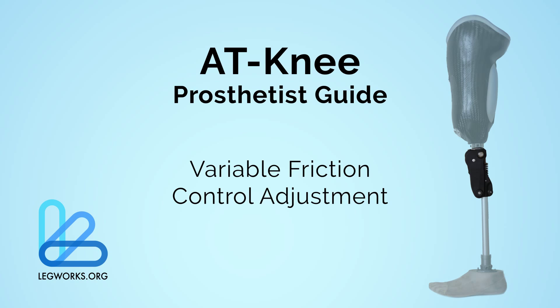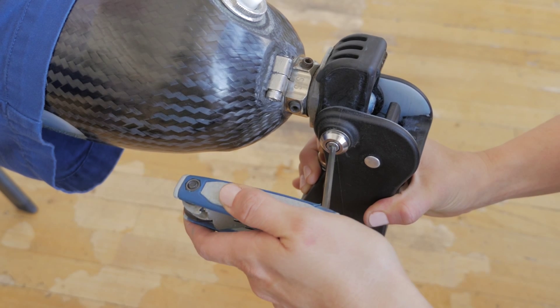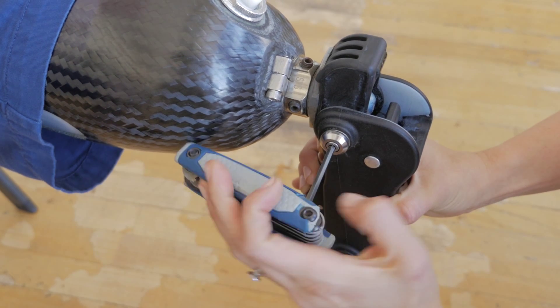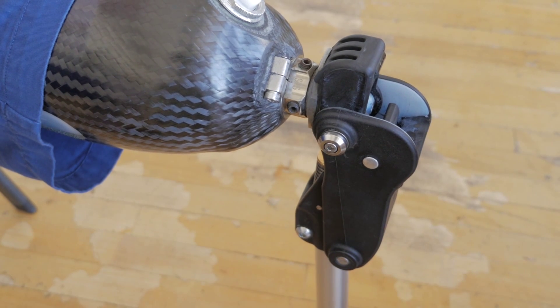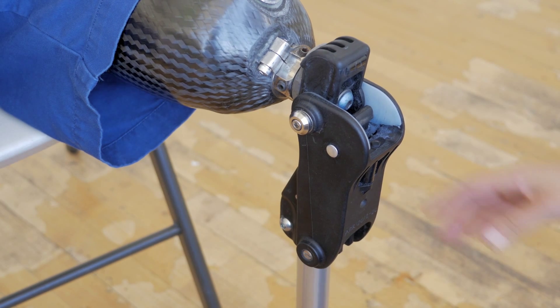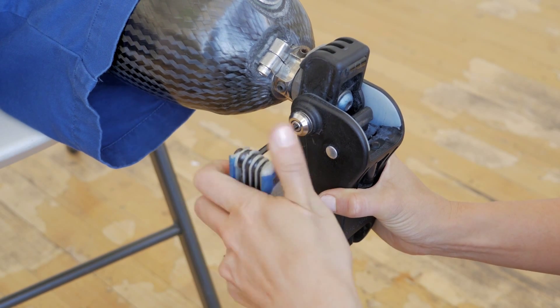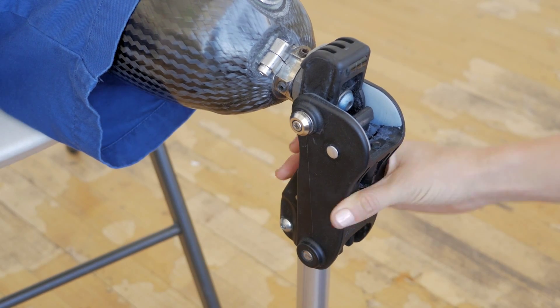Variable friction control adjustment is designed to allow the prosthetist to adjust the swing phase control specifically to fit the user's confidence in their gait and their walking speed capability. Users who walk at slower speeds and need the knee to make a noise upon terminal impact to signify the knee is locked should loosen the friction control to their preference. Higher mobility level users who walk at faster speeds and are more confident in their awareness of the position of the knee should tighten the friction control to their preference.